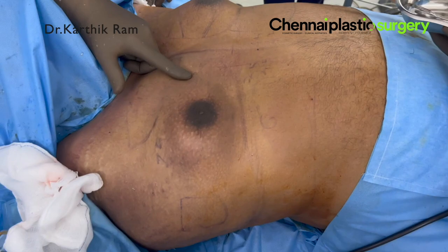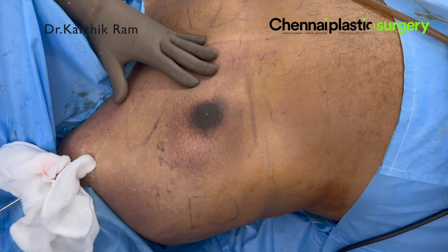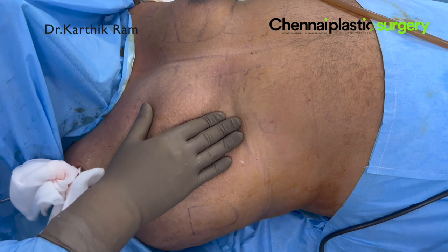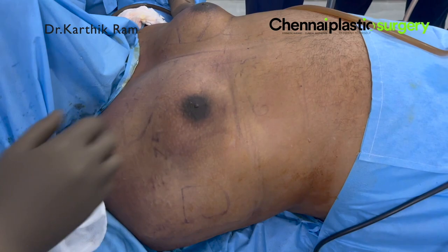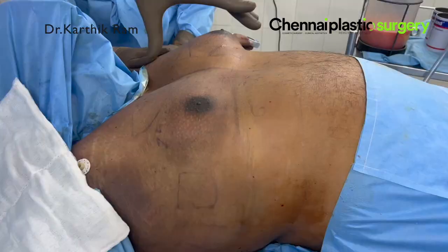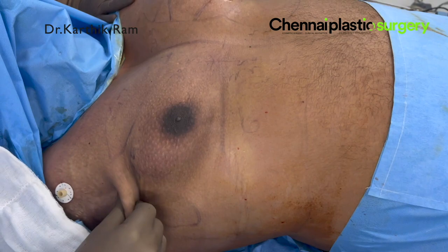Now we finish the deeper liposuction in the region. We remove superficial and deep fat below the pedicle area. On the sides, we completely remove superficial and deep. We want to give definition to the muscle borders. Below the gland, we do a little liposuction so that gland excision will be easier. Here you can remove completely superficial and deep. A lot of times we miss the deep fat on the side of the chest. Sometimes you feel that the bulge is still there because the deep fat in males is tucked underneath the deep fascia. So you have to pierce the fascia to reach the deep fat on the side of the chest — it will be a little tricky. Go slow and go closer to the rib cage.